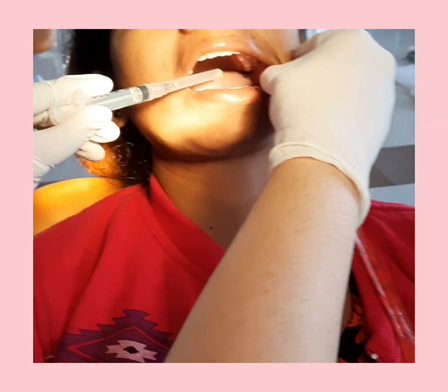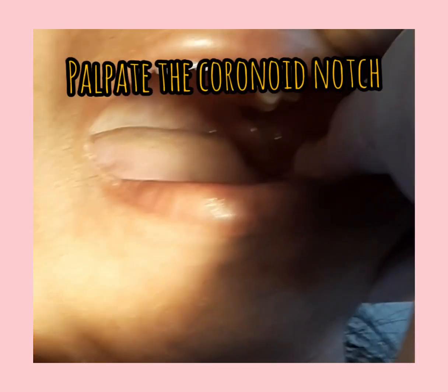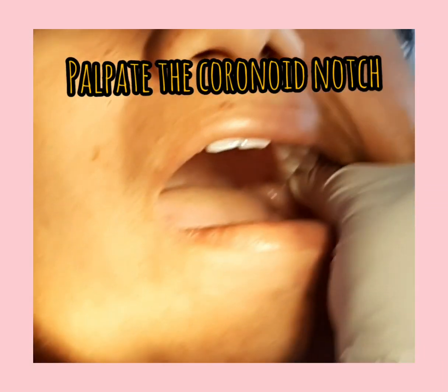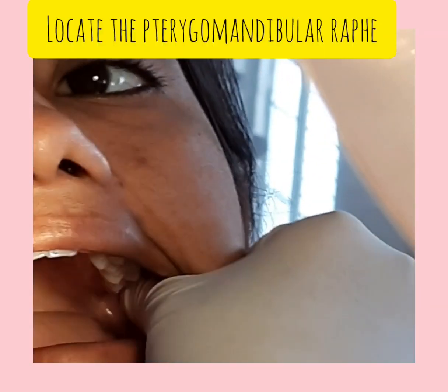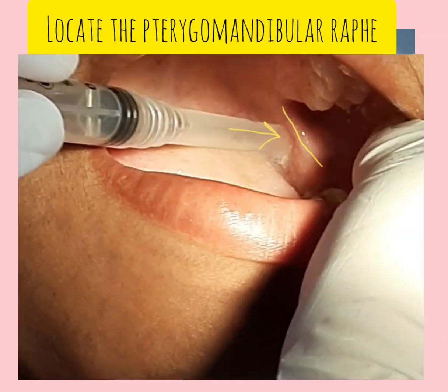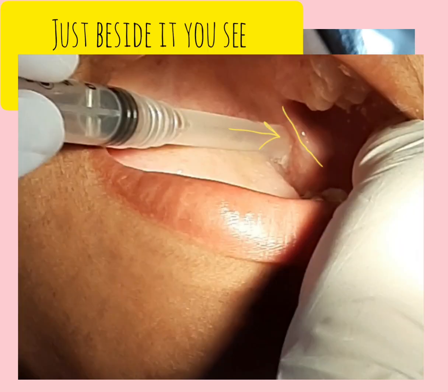First, we ask the patient to open the mouth wide and we palpate the coronoid notch — it's like a C-shaped bone you feel. You can see here I've drawn it. Keep the hand in the center. Now you can see the pterygo-mandibular raphé — I have marked it with an arrow or yellow line.